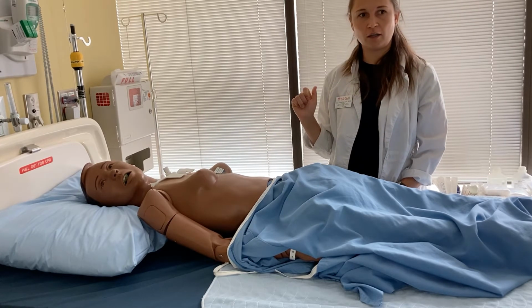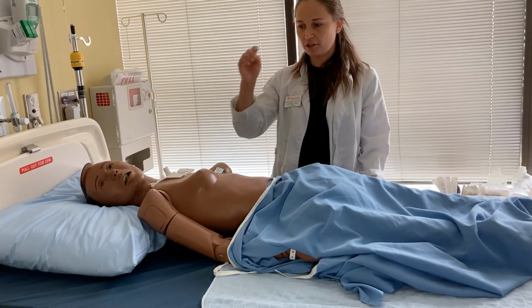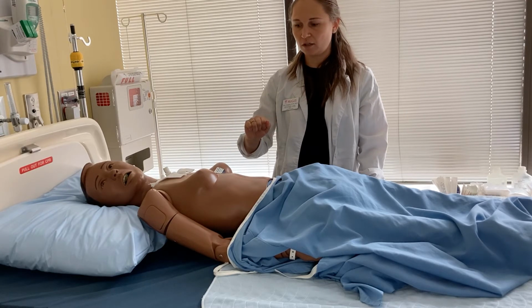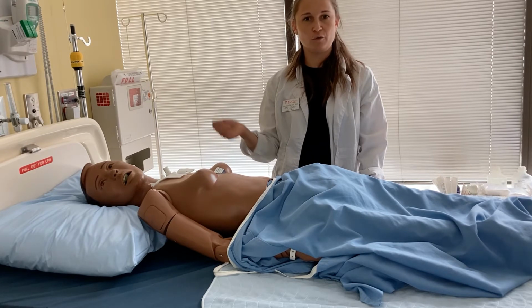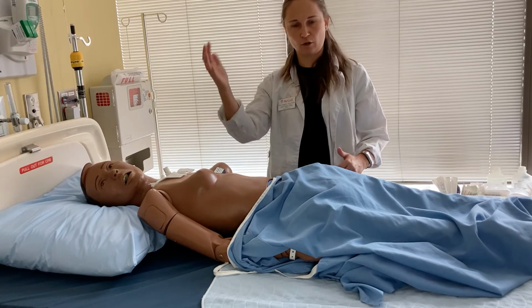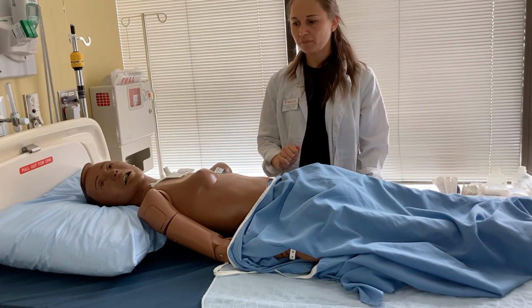As you recall, a 12-lead EKG usually views the anterior, septal, and a little bit of lateral and inferior parts of the heart. And when somebody asks you to do a 15-lead EKG, they're usually looking for a posterior view of the heart, which is really in the back and lower bottom that cannot be seen with a normal 12-lead EKG.